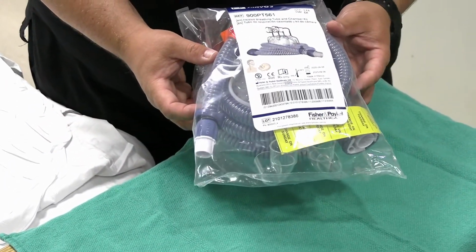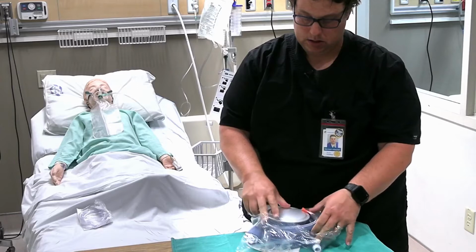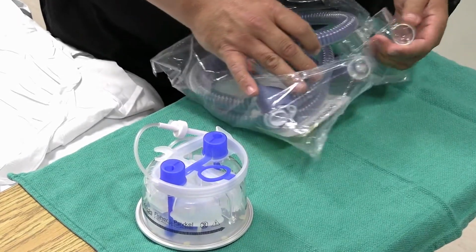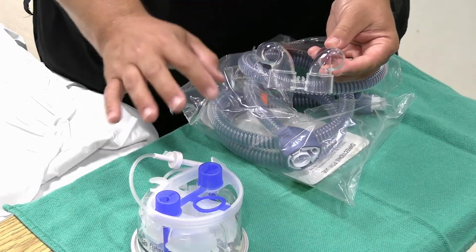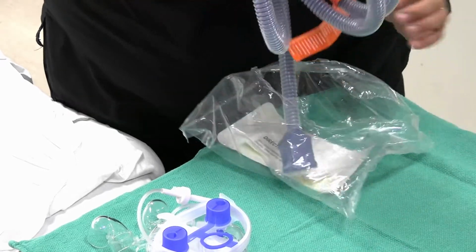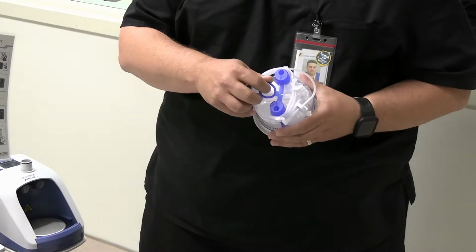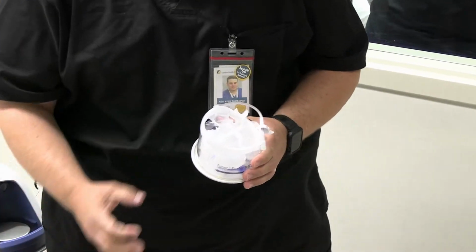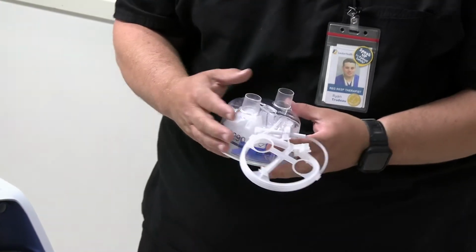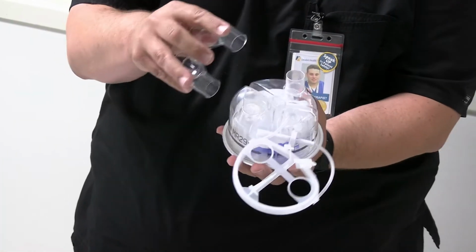So here's your universal patient circuit for the AIRVO. So I'm just going to open that up. Okay. So here is your humidifier chamber. This is your connection here that will attach your humidifier chamber to the AIRVO device and your heated wire patient circuit, just like so. Remove the covers from the humidifier here. The humidifier chamber there, they just pull out. I'm going to pull this ring off of here. This is going to be our fill line that's going to attach to your sterile water here. We're going to take the attachment device and attach that to your humidifier just like so.